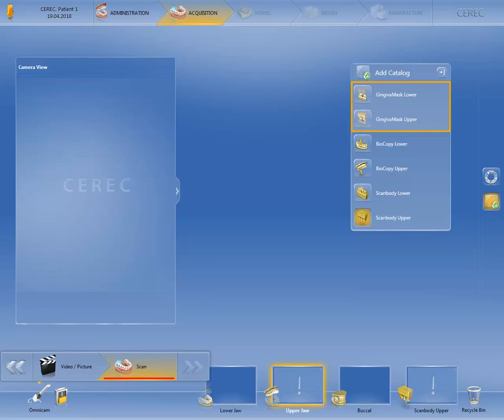As a result, it would then not be possible to optimally adjust the emergence profile of the restoration to the real situation. In such a case, reapply the gingiva former in the implant, remove it once again after 10 to 15 minutes, and scan only the area of the implant position and the neighboring teeth.